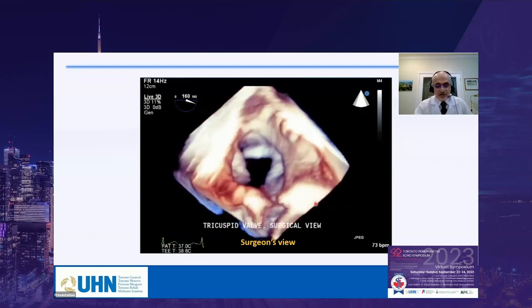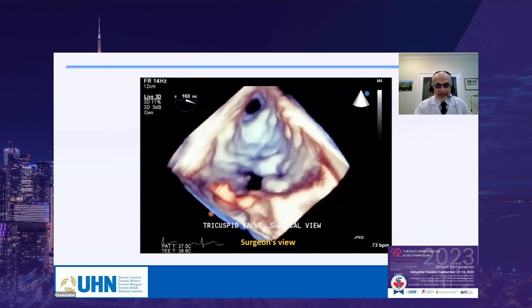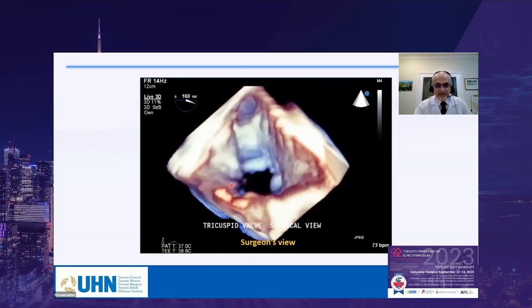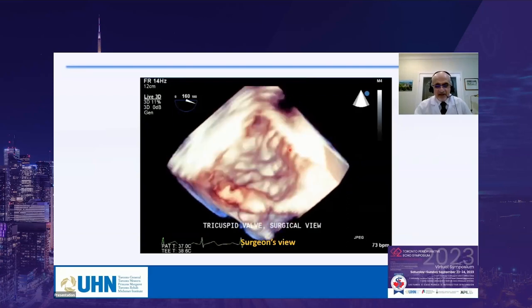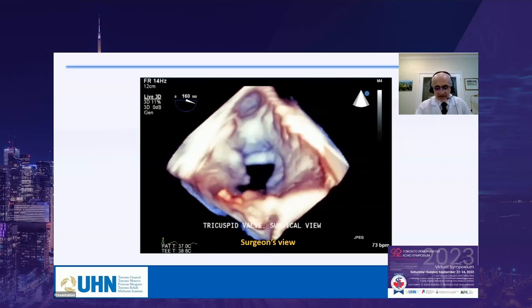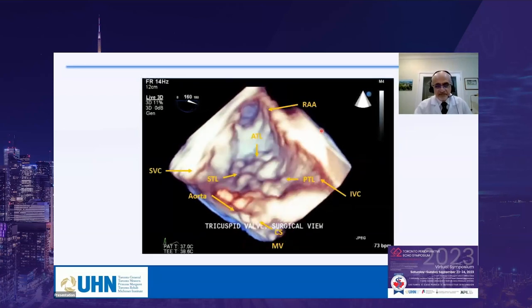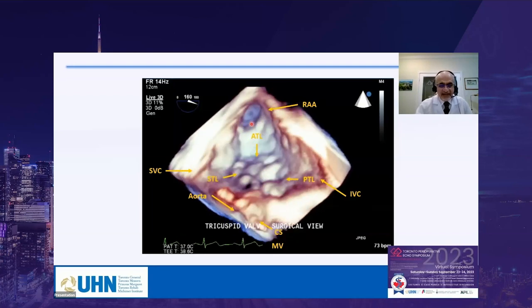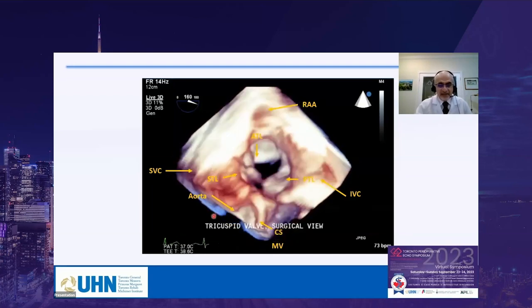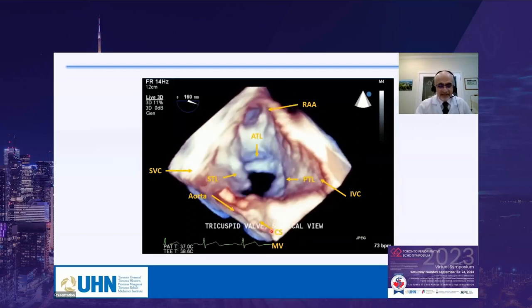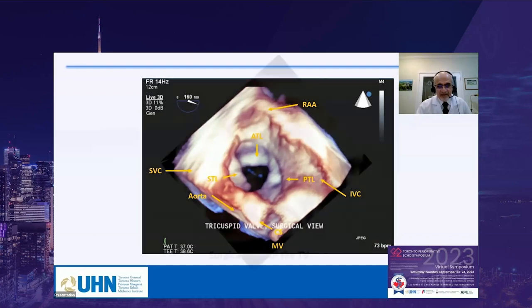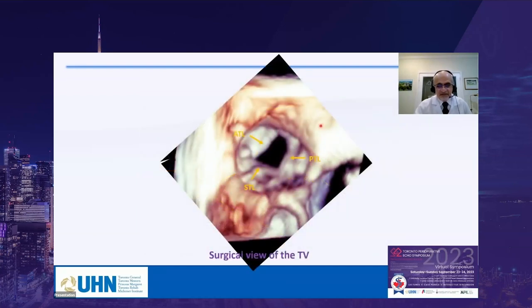Key landmarks in the 3D TEE surgical view of the tricuspid valve: the aorta is positioned below the image and the mitral valve nearby. The posterior leaflet, septal leaflet, and anterior leaflet — which lies beside the right atrial appendage — can be identified. The surgical view orientation: the anterior leaflet's landmark is the RA appendage and aorta, the septal leaflet's landmark is the interventricular septum, and the posterior leaflet's landmark is the IVC. The surgeon stands such that the posterior leaflet is to their right hand.